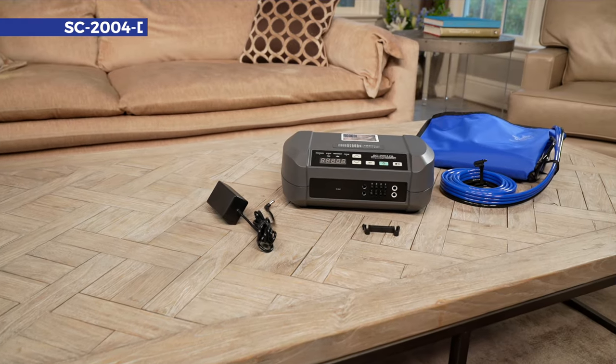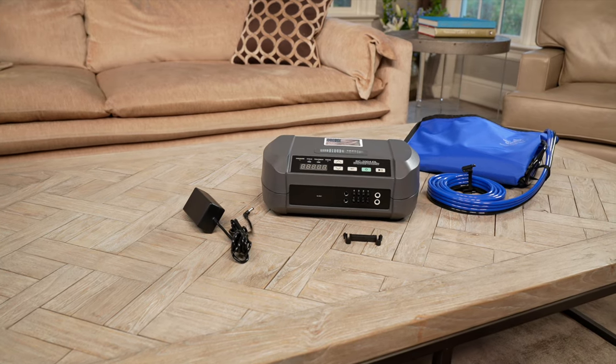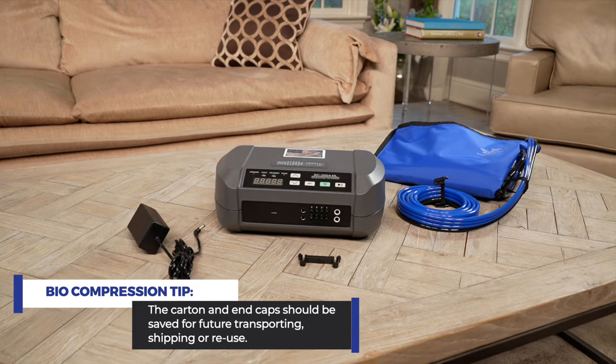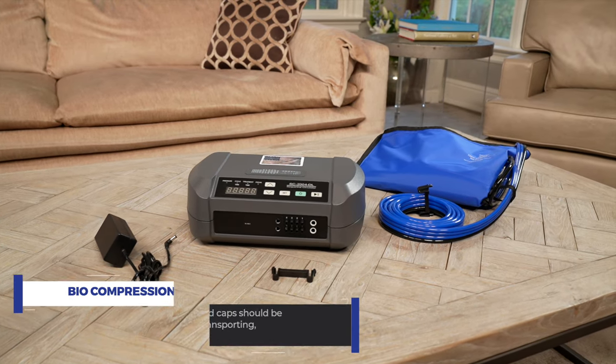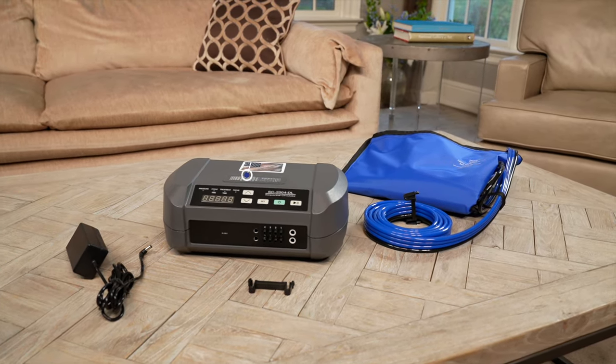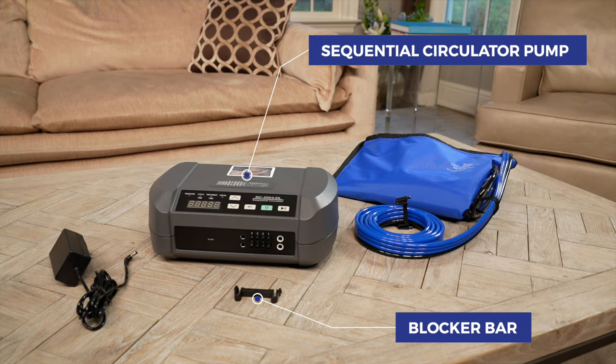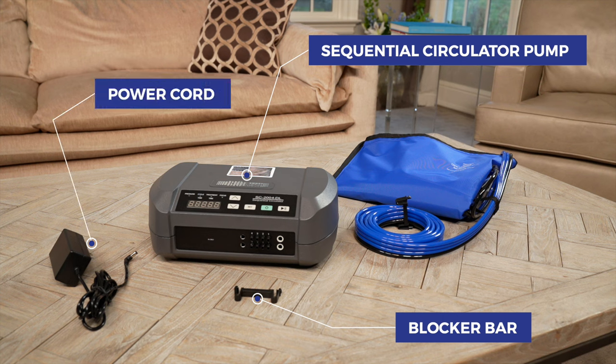First, unpack your biocompression pump and take out all of the components. The carton and end caps should be saved for future transporting, shipping, or reuse. Make sure you have the following items in the box: a sequential circulator pump, a blocker bar for use during single garment therapy, a power cord, and an instruction guide.